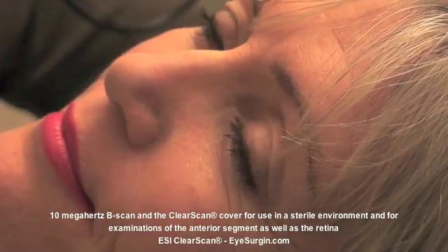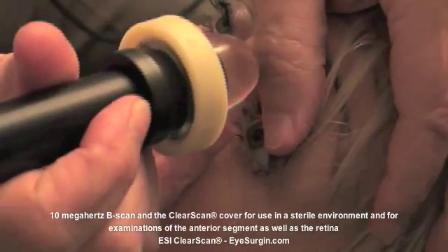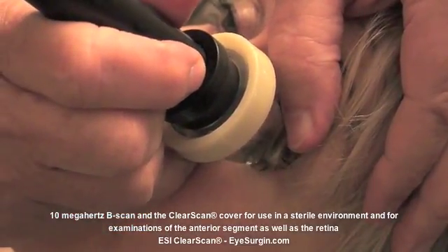The image will not be as detailed as a 25 MHz or 50 MHz UBM, but the 10 MHz is adequate to identify gross pathology without having to buy other equipment.